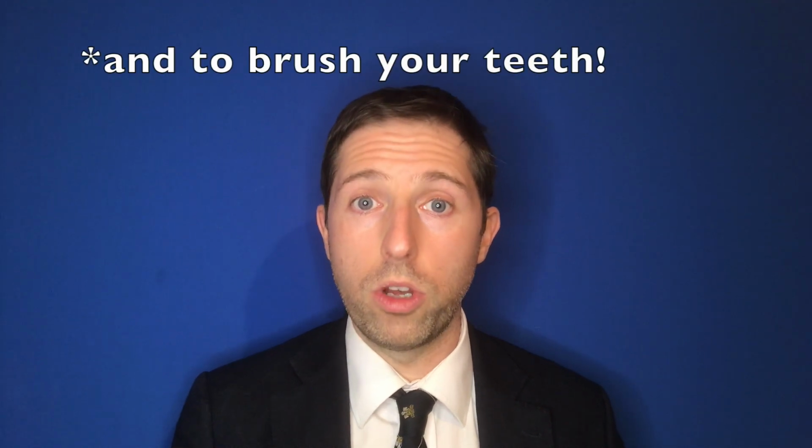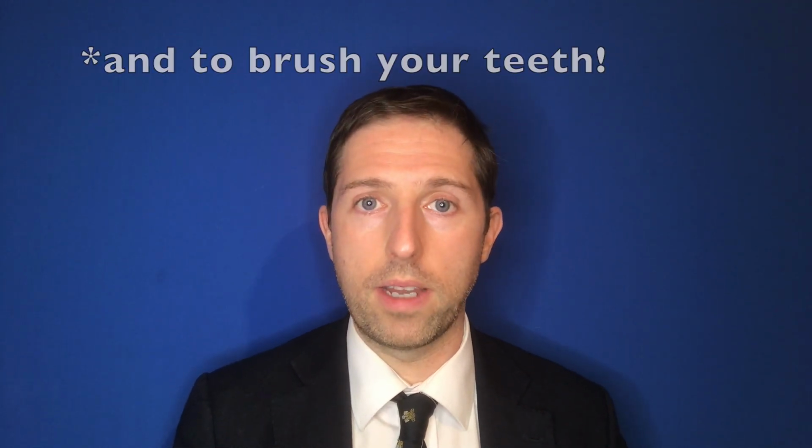Other things you can do to minimize that wear are to wear the retainer during the day as opposed to the night. So perhaps if you're a child, from when you come home from school until bedtime, taking them out for dinner obviously, or work-wise when you come home from work until bedtime. The rationale for that is that when you're awake, you're far less likely to grind your teeth than when you're asleep, and you can consciously take more care of them.